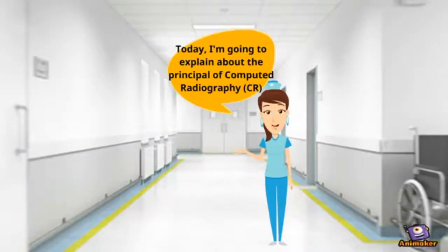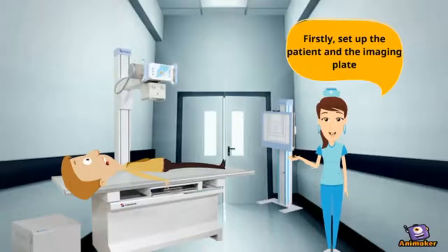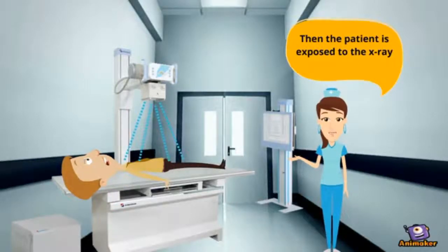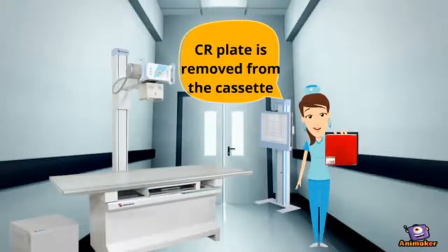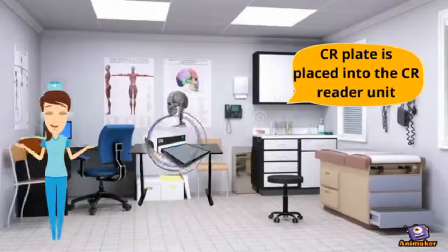Today, I am going to explain about the principle of computed radiography, CR. Firstly, set up the patient and the imaging plate. Then, the patient is exposed to the X-ray. After the exposure of X-ray, the CR plate is mechanically removed from the cassette and the CR plate is placed into the CR reader unit.